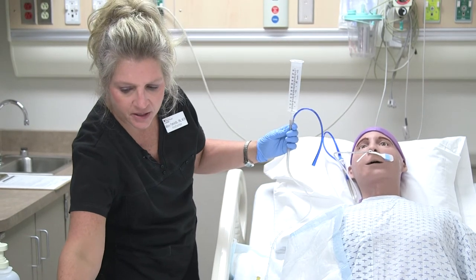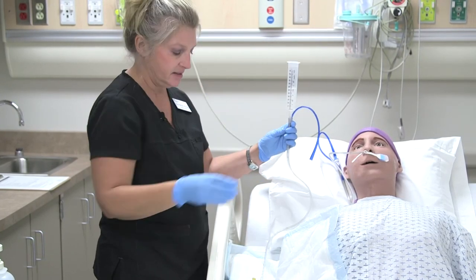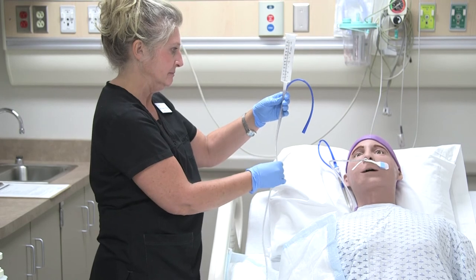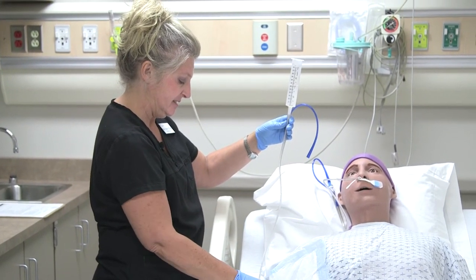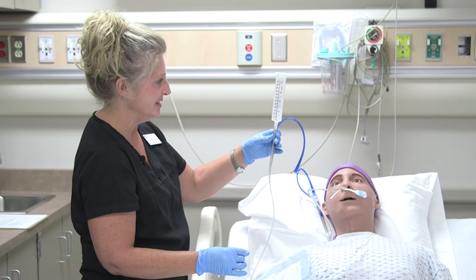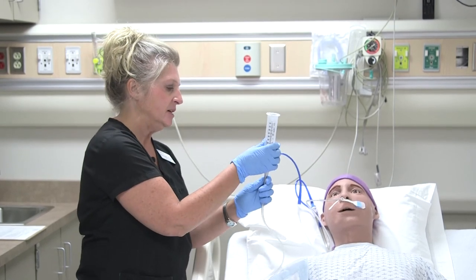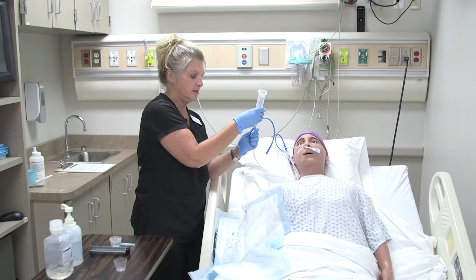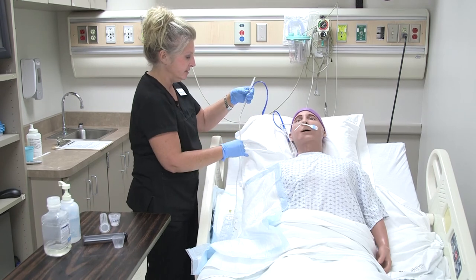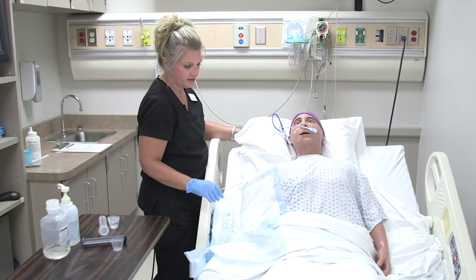And then our final flush of 30 mls. This just clears the tubing and makes sure nothing is getting stuck in there. We'll let that go in as well. Now we're done with our medication administration. I'm going to put the stopper back on. Make sure to clamp it for at least 30 to 60 minutes to ensure those medications get absorbed before putting it to suction, if it was going to suction.